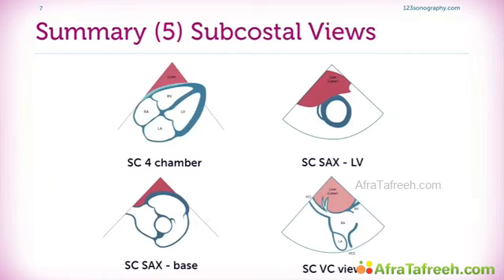The subcostal views are very important as well. You can get a view which is very similar to the 4-chamber view, but this time you have the septum slanted more towards the right of the screen. You can see the pericardium very nicely and the 4 chambers. Short axis views can be performed from a subcostal approach just the same as for a parasternal approach. Again, a very similar view to what we've seen before.